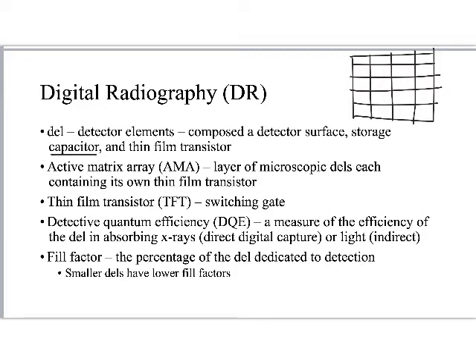And finally, there is a fill factor. If you look on textbook page 593, there's a figure 34.2, and it looks something like this. It has a very tiny illustration of a DEL, right? This part up here is the TFT, and this part down here is the storage capacitor. Everything that I'm shading in blue here would be related to its fill factor, right? It's important to think about that, because the larger the DEL is, the better its fill factor will be, just due to the limits of engineering. So it would have a higher fill factor.